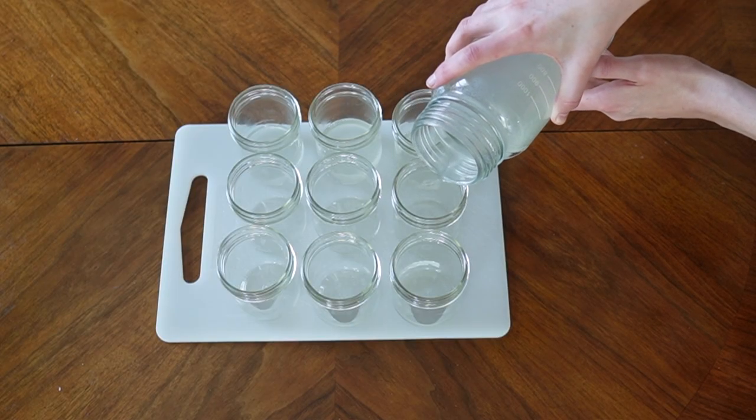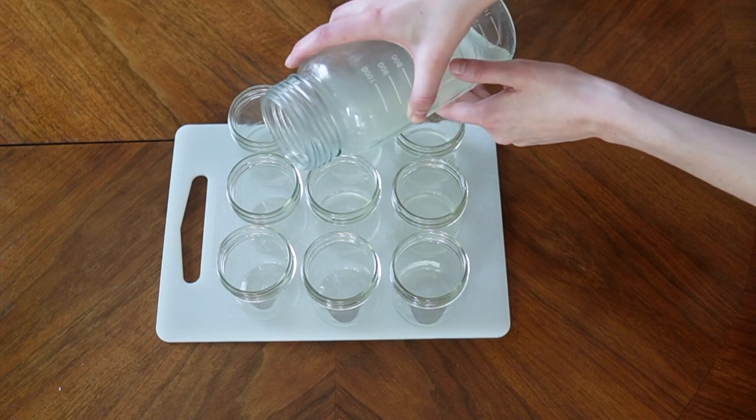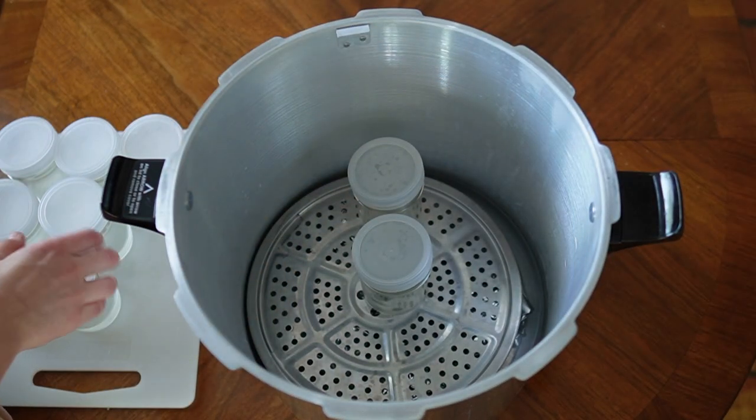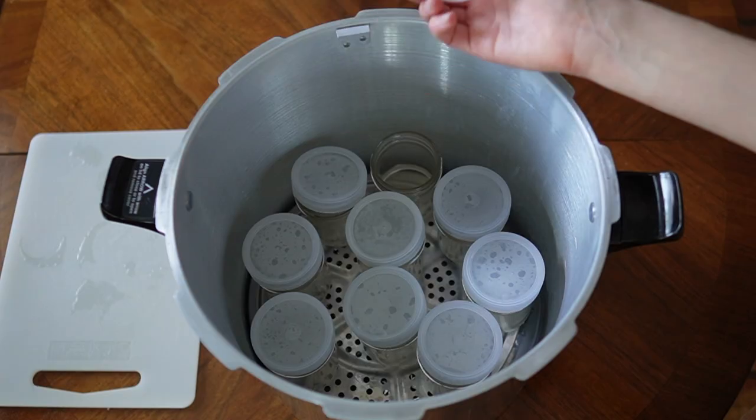I pour my tissue culture media into individual 250 milliliter containers, then begin placing the tissue culture jars into the pressure cooker on top of the platform. None of the lids get secured onto the jars — they just sit lightly on top. Securing the lids will create a pressure differential inside the jars and can cause them to explode inside the pressure cooker. Also take care not to have the jars touching each other. The 23-quart pressure cooker can hold around 9 or 10 jars comfortably.